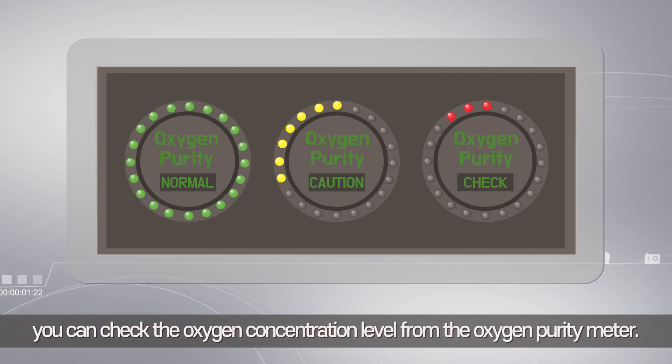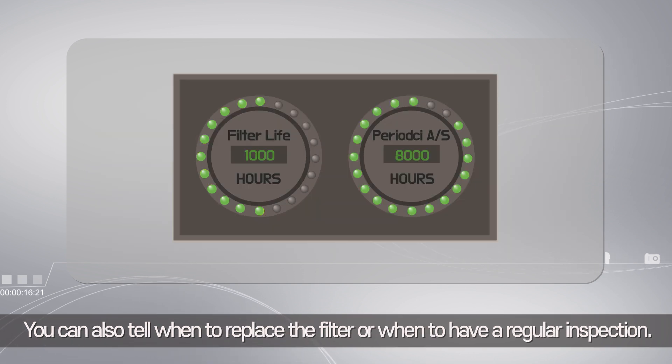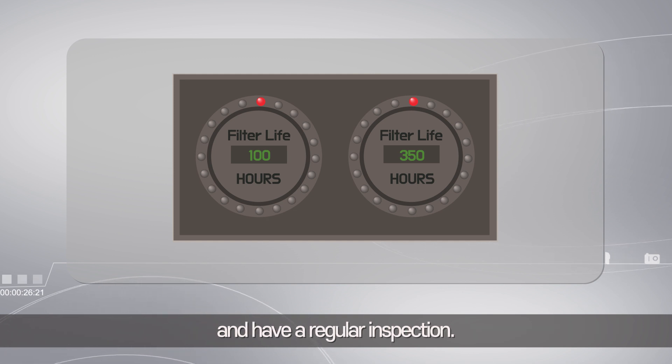In the display window, you can check the oxygen concentration level from the oxygen purity meter. You can notice the purity level from 73% to 93% through the number of lights on it. You can also tell when to replace the filter or when to have a regular inspection — when the remaining space is one or less, it is time.